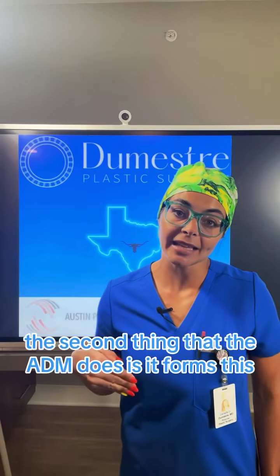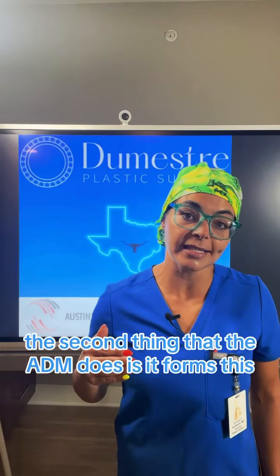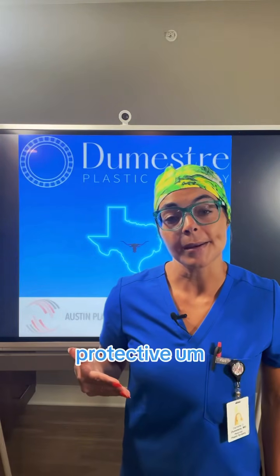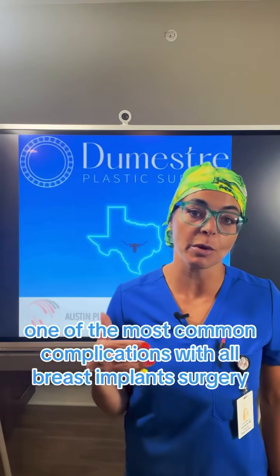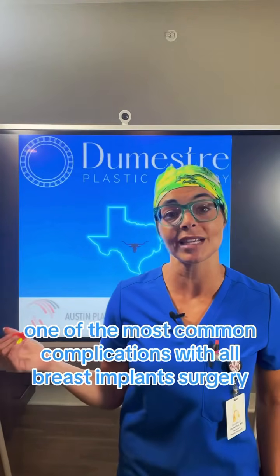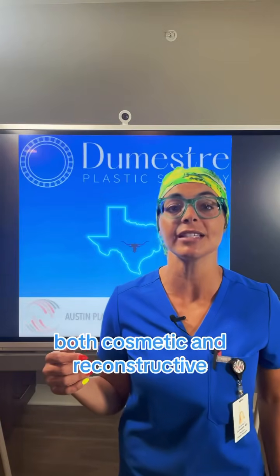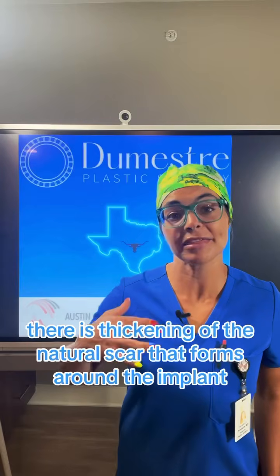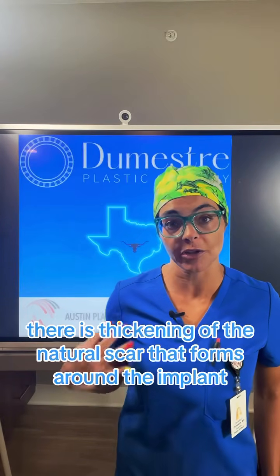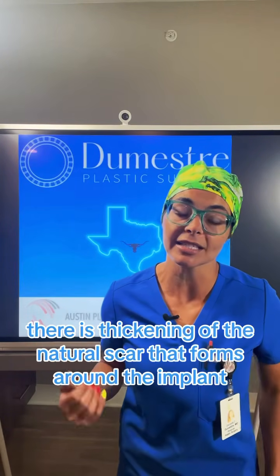The second thing that the ADM does is it forms this protective barrier against capsular contracture. So capsular contracture, one of the most common complications with all breast implant surgery, both cosmetic and reconstructive, is when there is thickening of the natural scar that forms around the implant.